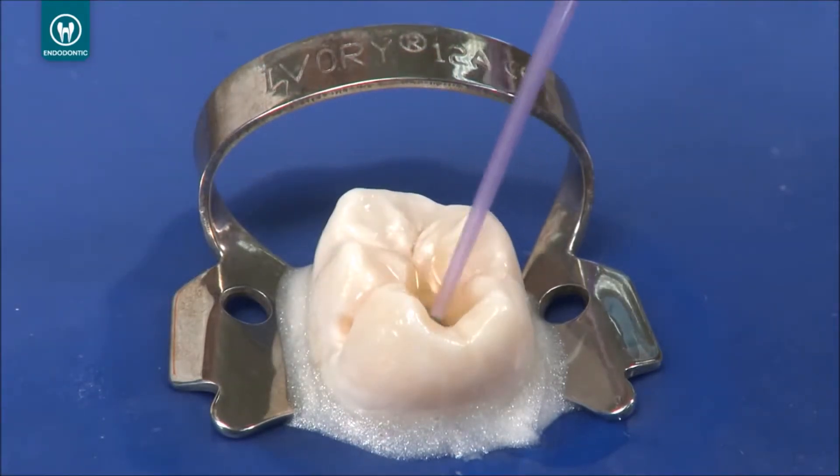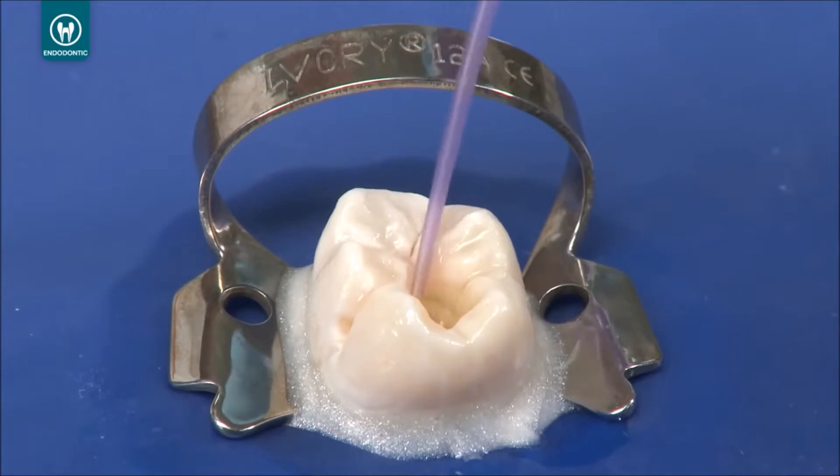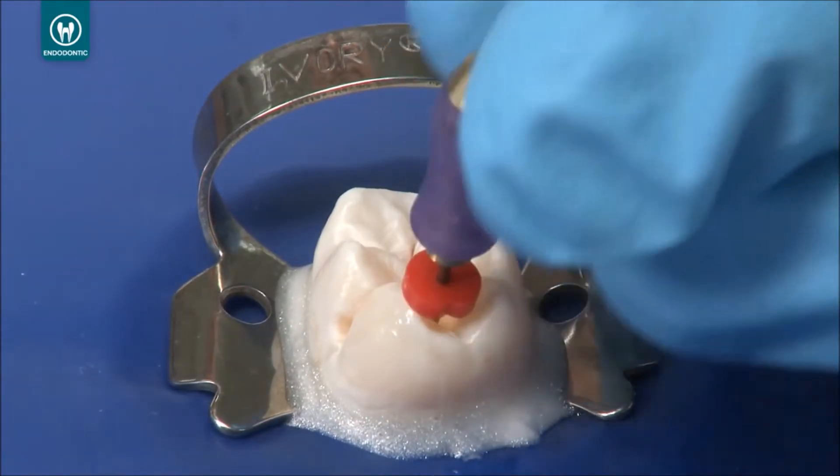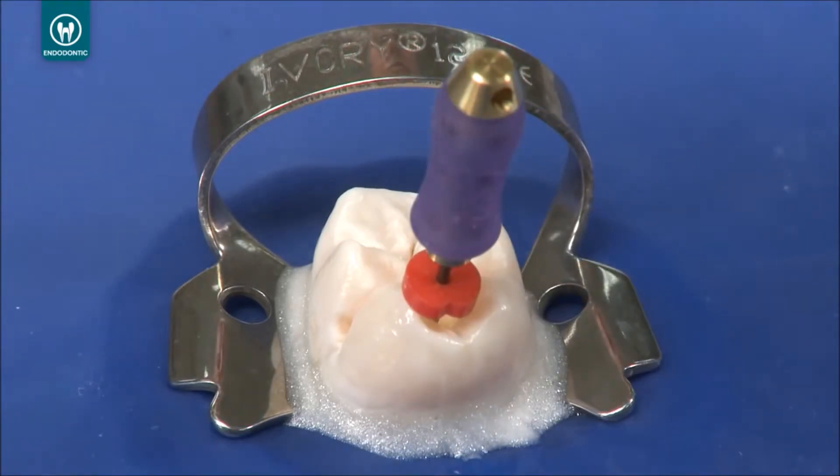Suction the excess solution from the pulp chamber with a capillary tip, leaving only the canal wet. Depending on the size of the canal, insert a number 15 hand K file or another appropriate file into the canal.